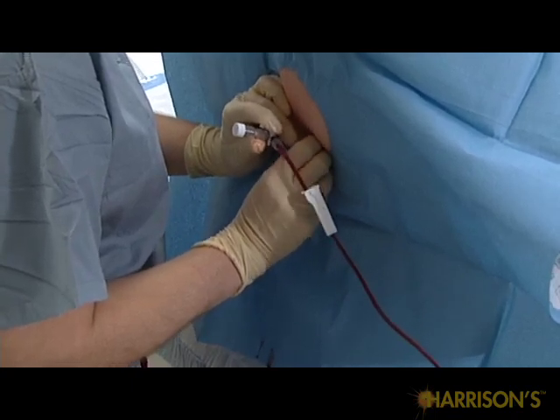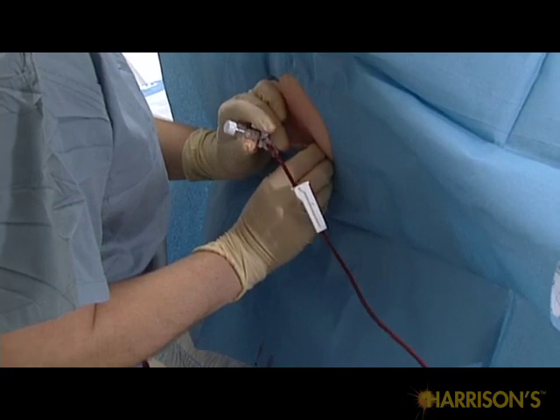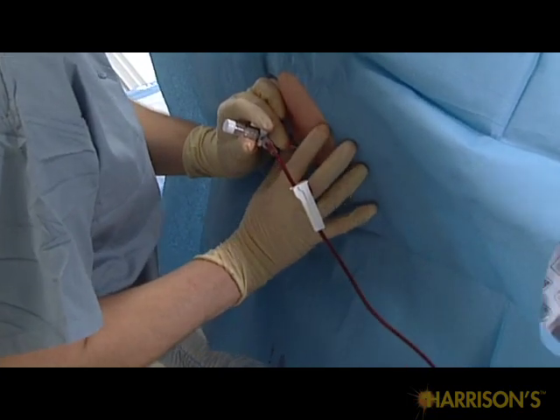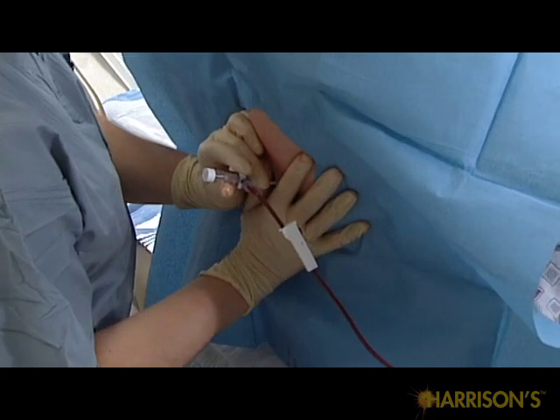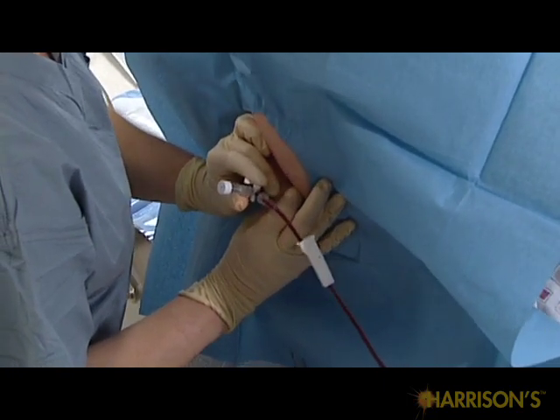Once flow stops, you may feel the sensation of the catheter suctioning against the chest wall and/or lung. Do not continue to suction for extended periods once you feel the space is drained. Even a soft catheter can induce parenchymal injury.